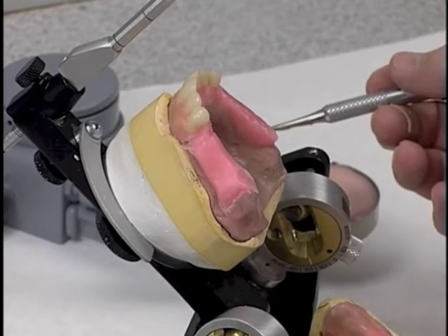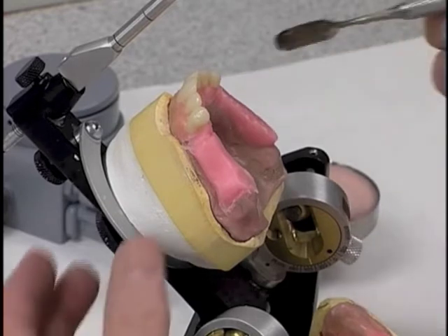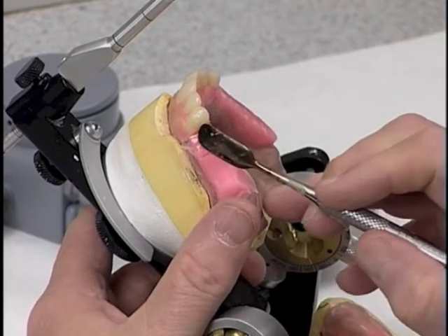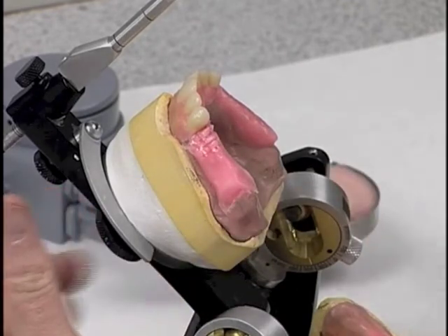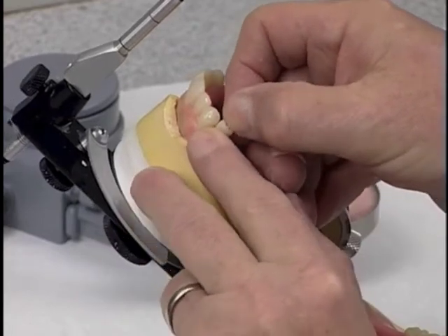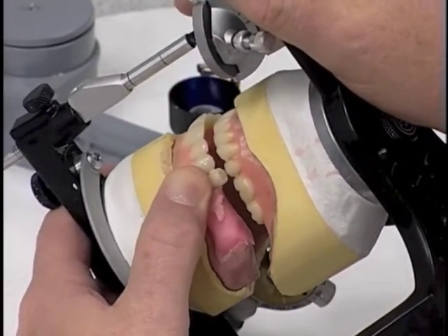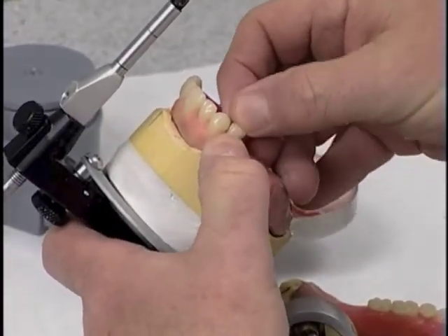So we're going to pool the wax in the area of the maxillary premolar, remembering we're using second premolars and not first premolars because we're only putting 3 teeth in each quadrant. So we pool the wax, take our second premolar, place it into the wax, and start checking occlusion. Now, we have a little more horizontal overlap of the canines on this side, so by necessity we'll end up with not an awful lot of lingual cusp contact on this tooth.